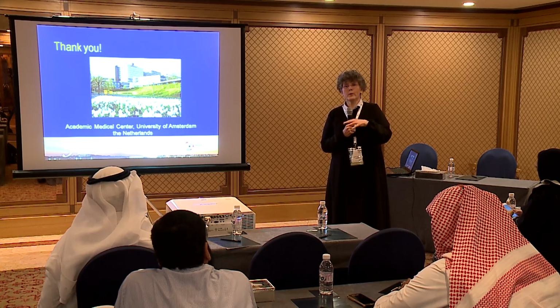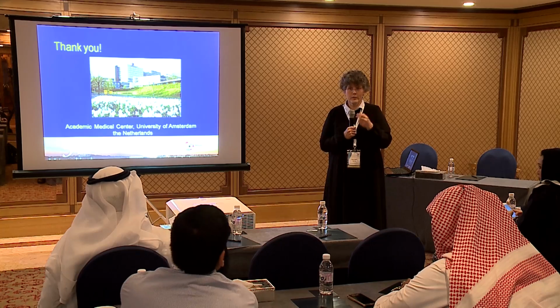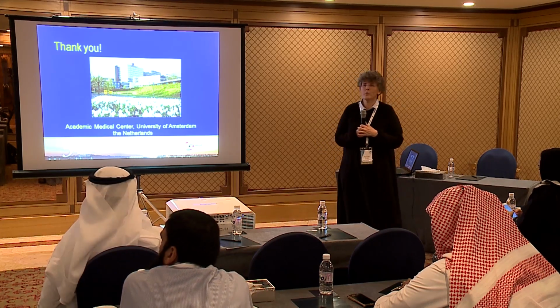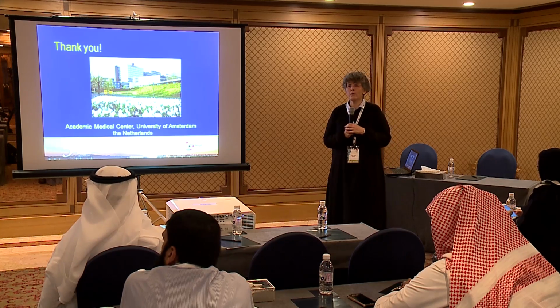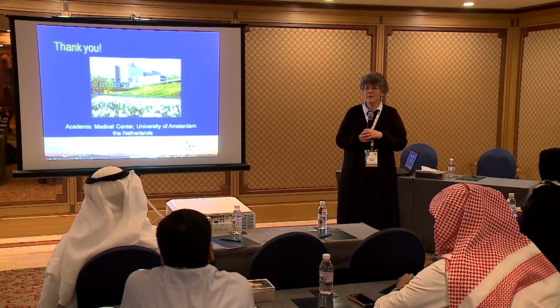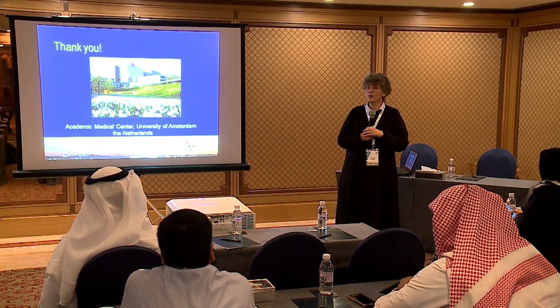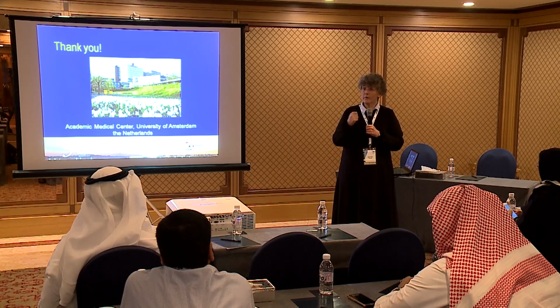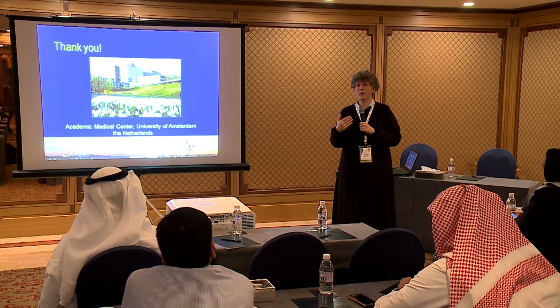In the hospital, we would use the old one because of money issues. In the other one, I'm not sure what we would do. We'd probably just put the patient through all the tests again and then decide what to do. Okay, and I also would take into calculation the result of the first eye. You have the result of the first eye from your first measurement, so you know how you came out.